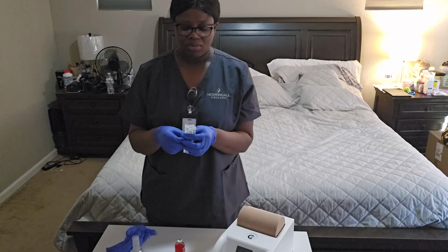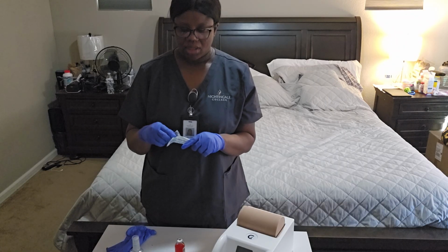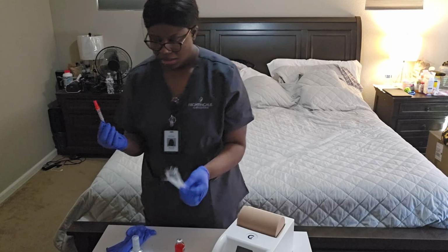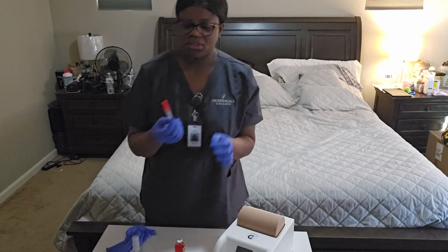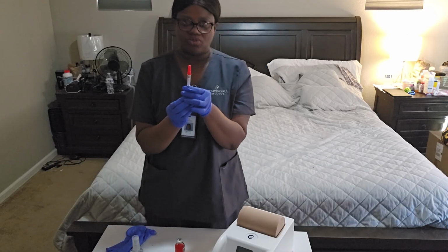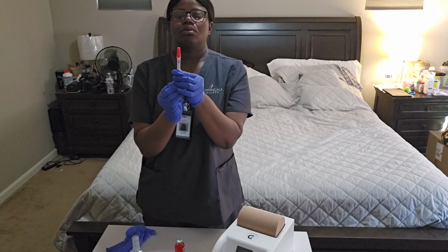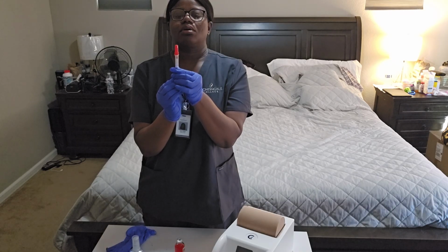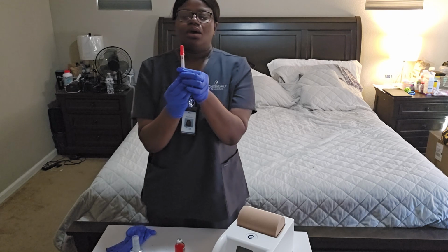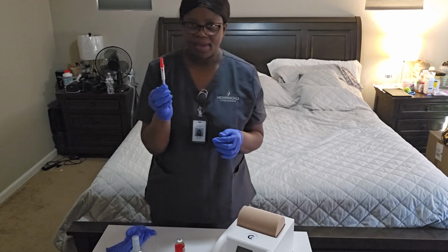Okay, I'm going to open this up and dispose of this. So I'm going to draw up 0.1 ml of air. I have drawn up 0.1 ml of air.